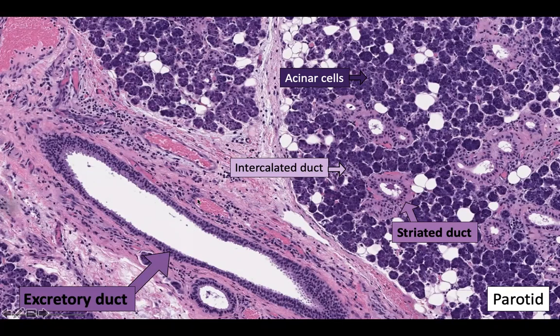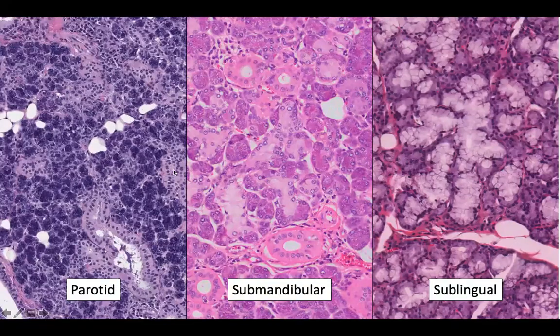Awesome. Okay, and then if you look at the histology of the major salivary glands, this is something that we like to pimp the residents on. So this is a good slide to pay attention to for when you roll around on the head and neck pathology service, because we'll probably ask you about it.